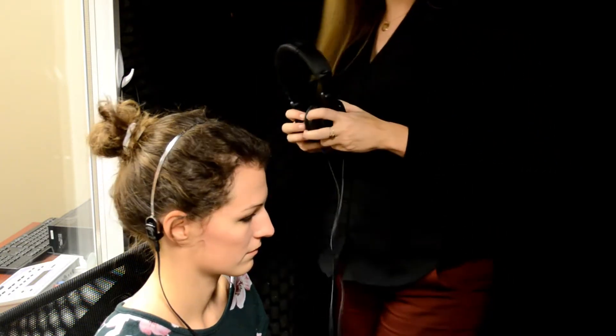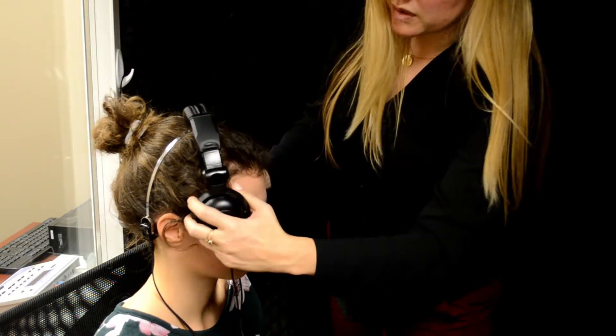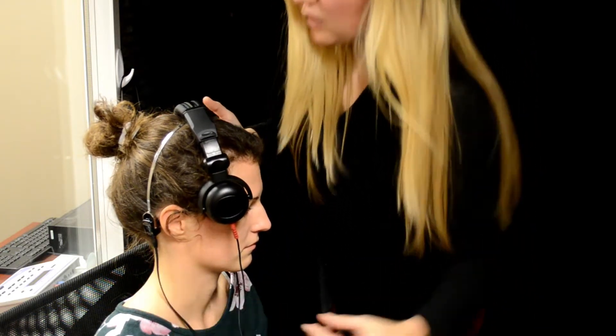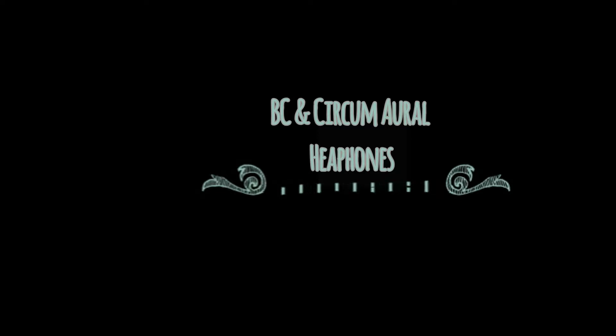When you go to put the headphones on, you're going to put the left ear cup on the ear, and then you just want to place the right side somewhere to where it doesn't move your bone oscillator.